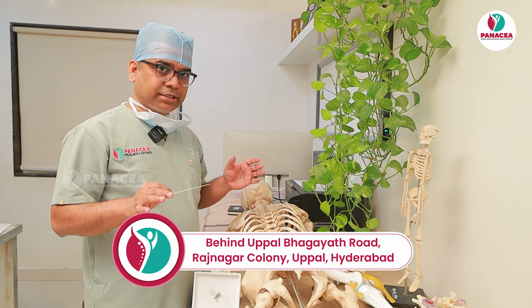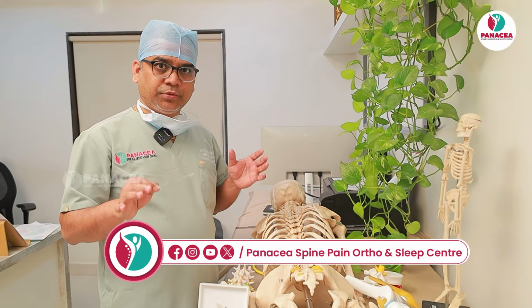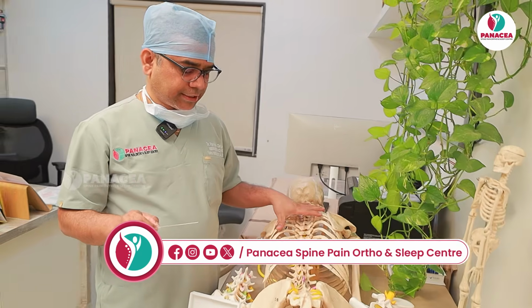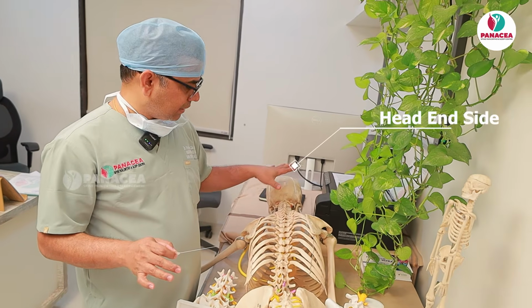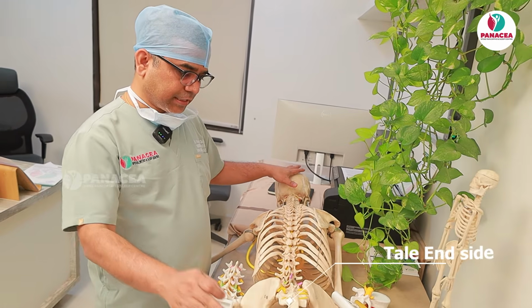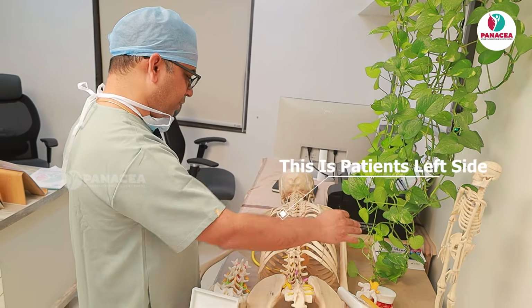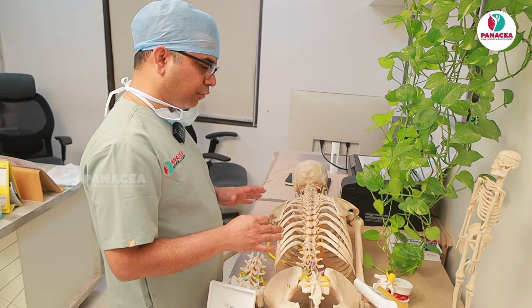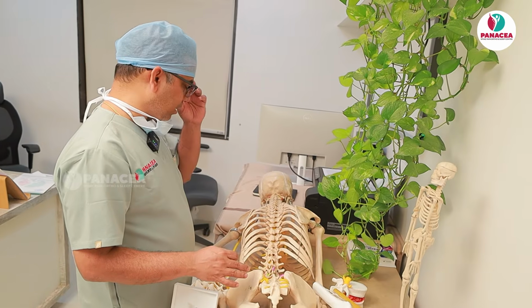Now I will discuss how we perform a transforaminal epidural. If you see here, this is a skeleton of a human being. This is the head end, this is the tail end, this is the patient's right side, this is the patient's left side. Now I will show you how to perform Kambin's approach for epidural steroid injection.